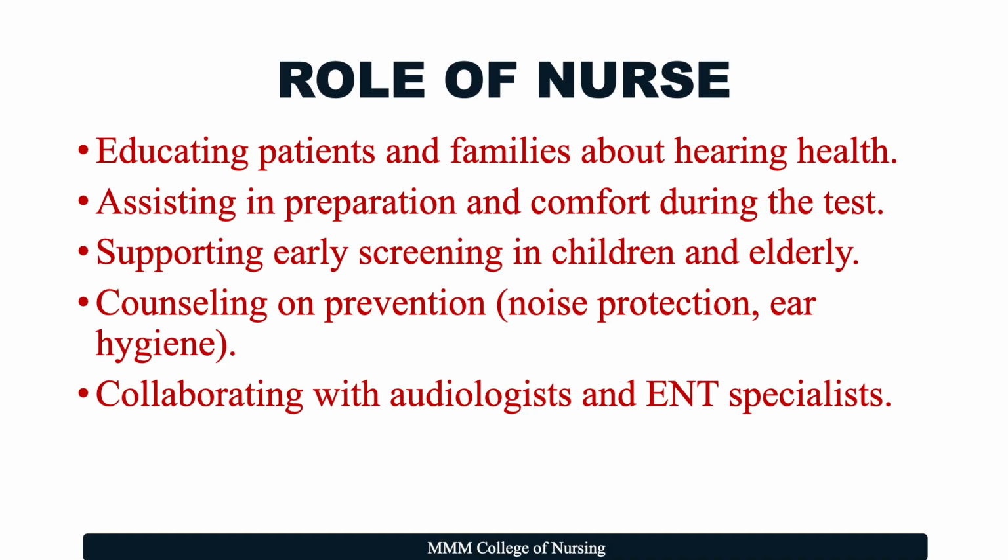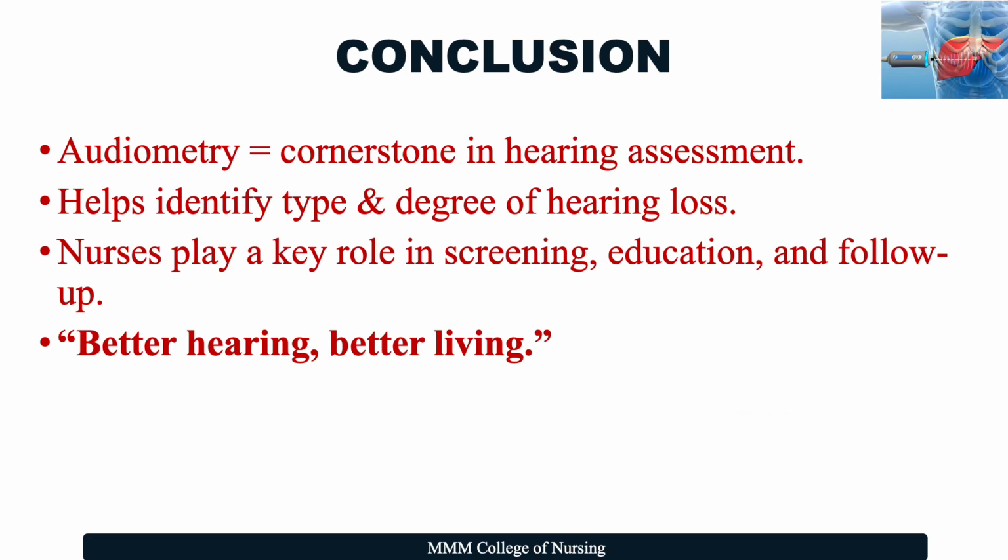Finally, moving on to the role of the nurse. The nurse plays a role in educating patients and families about hearing health, assisting in preparation and comfort during the test, supporting early screening in children as well as the elderly, counseling on prevention, such as noise protection and ear hygiene, and collaborating with audiologists and ENT specialists.